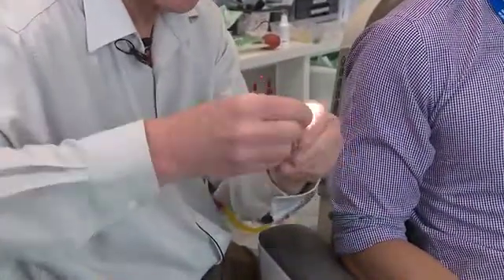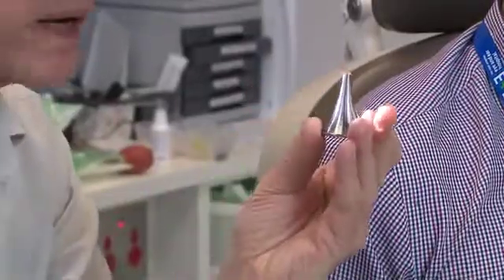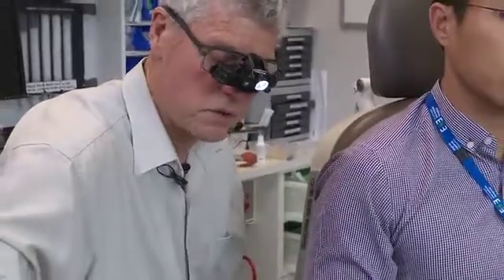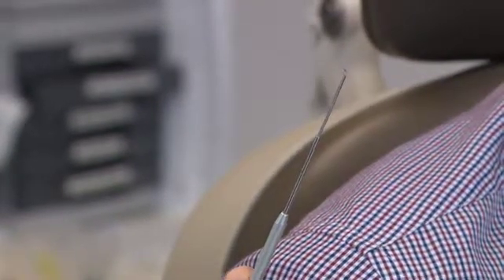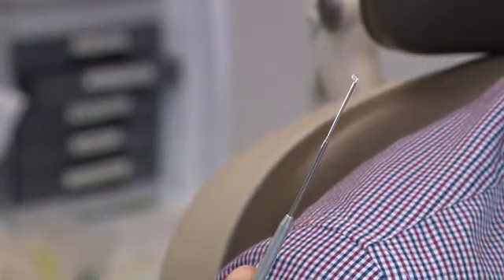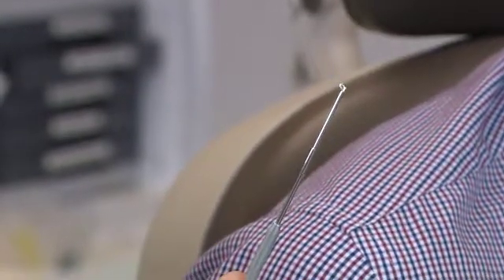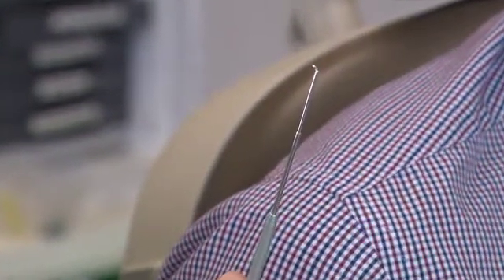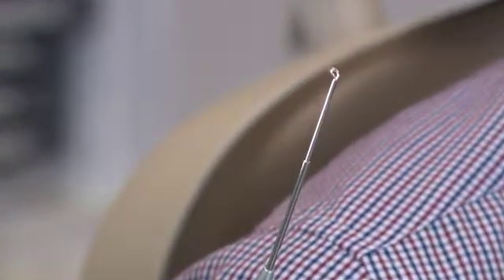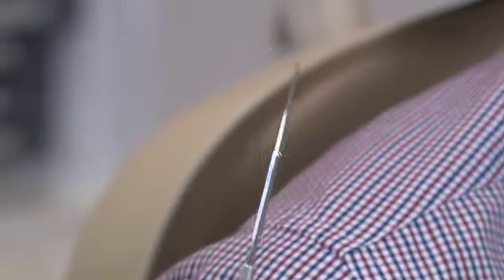If you look at the bit that really matters, which is just the third that's closest to the ear, they should be identical anyway. So mostly in clinic you'll find these; mostly in an operating room you'll find those. The wax rings vary in size from slightly smaller to twice as big. The advantage of the really small one is that you can more easily get under that bit of wax and lift it — that's the way you can loosen wax without hurting people. But then the small one, if you try and pull wax with it, is likely to pull through the wax. So often you have to use a small one and then a bigger one. Unless the end looks roughly like that — 45 degrees, strong and thin — which you can only get with metal, it's going to make life harder. So even if you use a different disposable one most of the time, it's a good idea to have something made of metal for the difficult ear.